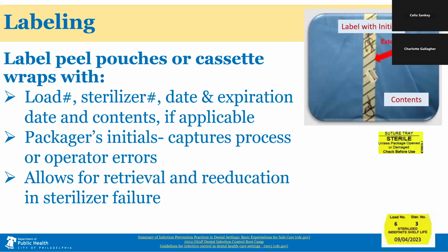Next, labeling packages with the load number, sterilizer number, date, and operator's initials allows for a recapture of all items on a failed spore test, and helps to enhance training for operator errors that may be detected.